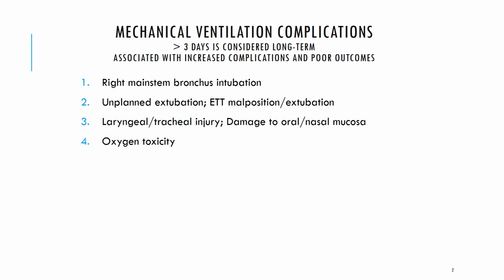So now you can kind of think back to when we talked about ventilator settings and FiO2 and PEEP. This is why if our patient has an FiO2 of 50% or higher, but they're not oxygenating well, we look at increasing PEEP instead of just cranking up that FiO2, which could put our patients at risk for oxygen toxicity.